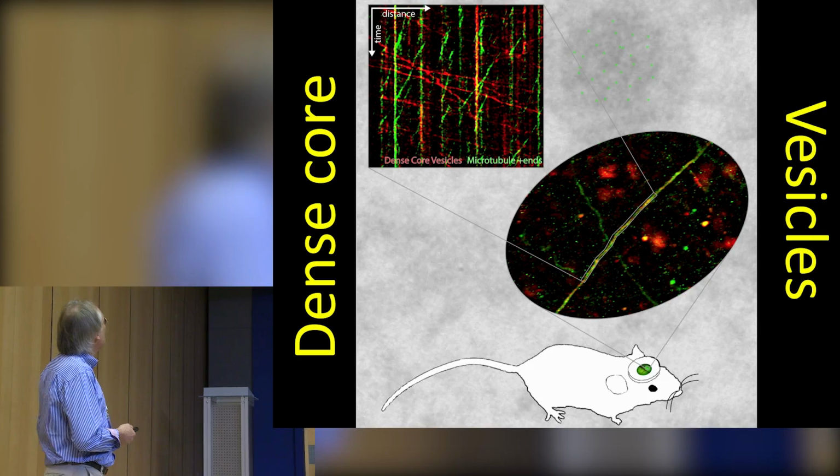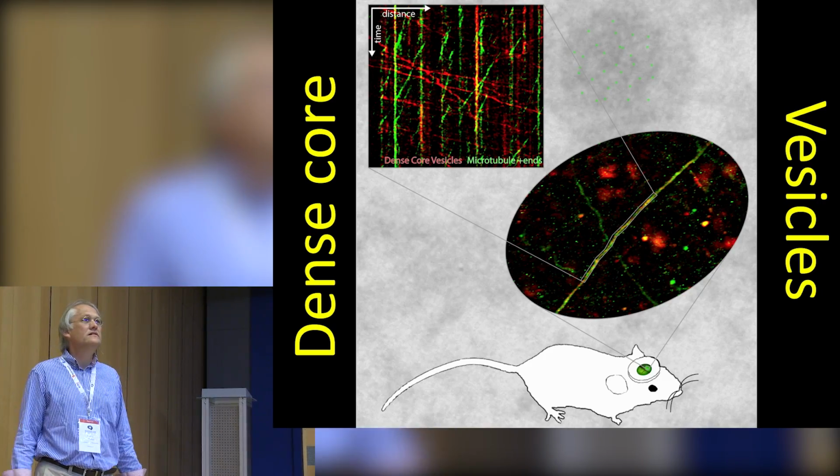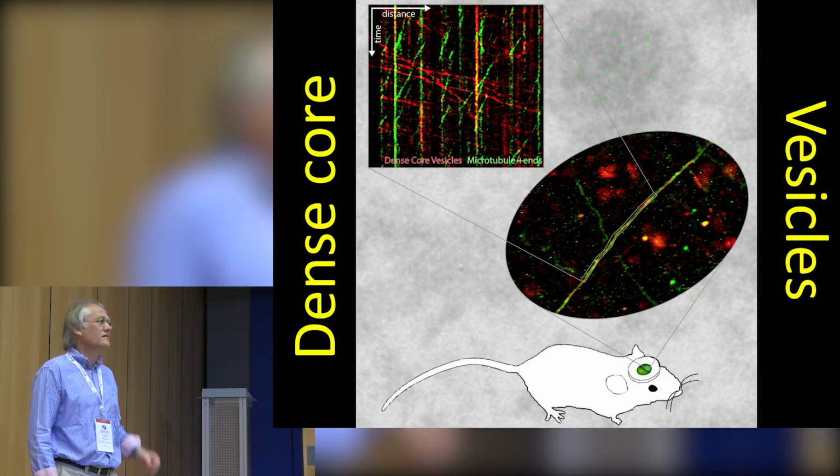You can see this really neat optical sectioning property of this technique. Here, this is the soma with this membrane-bound GFP. And then as we get deeper, towards 500 or below, the signal is getting less strong. So this is how this kind of data typically looks, so that you have an idea what we're talking about here. All right, so let's start with the first topic.